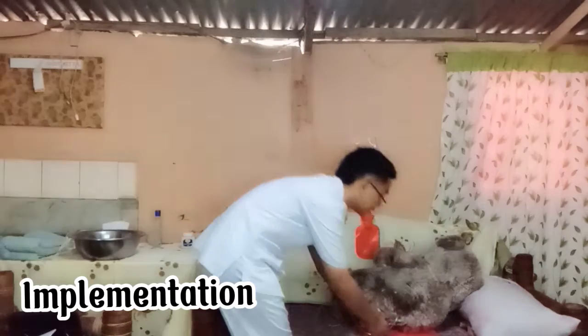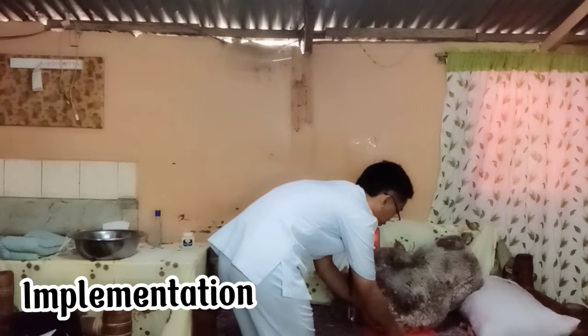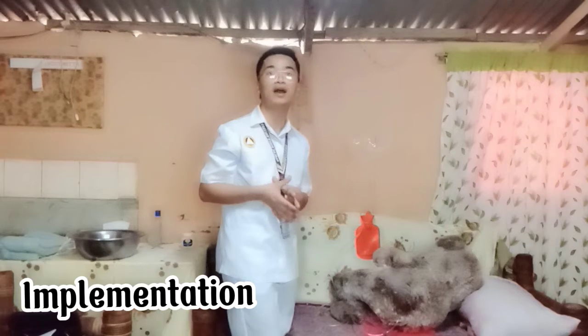Then, raise the solution container and open the clamp to allow fluid flow, or compress the pliable container by hand. Okay, so we're now going to open the clamp to allow the fluid to flow. Always remember that during most low enemas, hold or hang the solution container no higher than 30 cm or 12 inches above the rectum. But during a high enema, hang the solution container approximately 45 cm or 18 inches above the rectum.